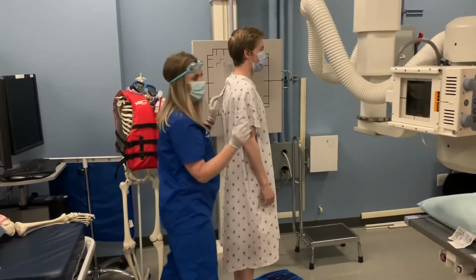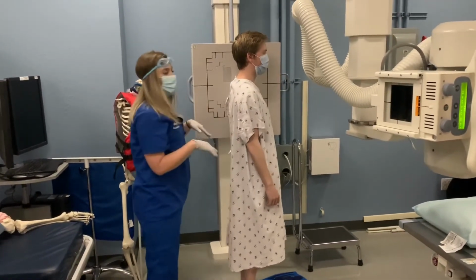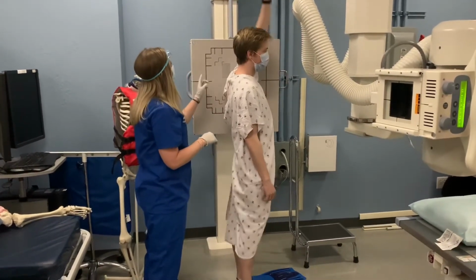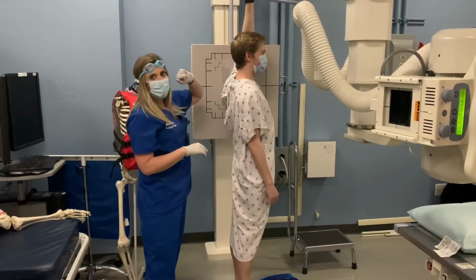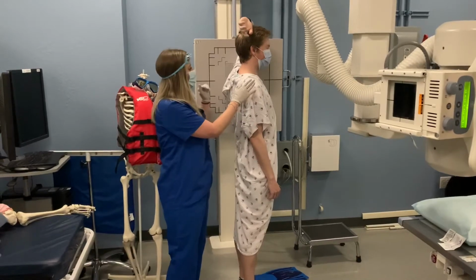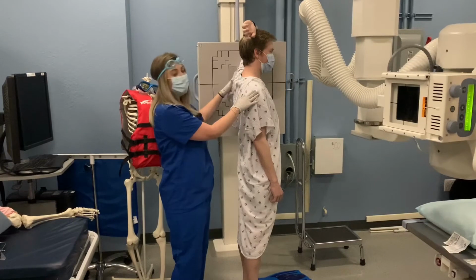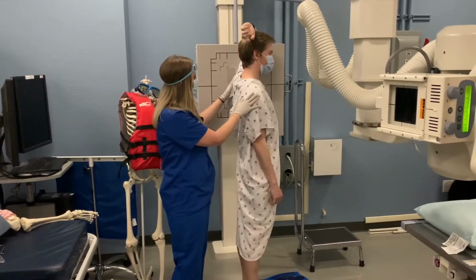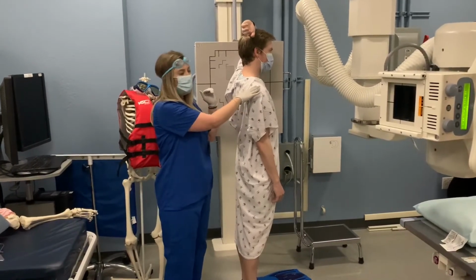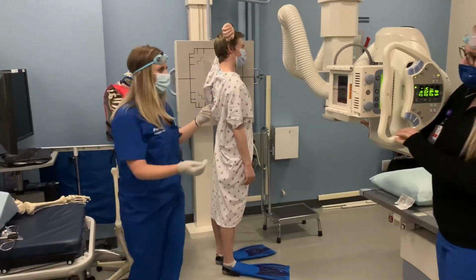All right, now from here, the arm that's closest to the IR is going to be raised above the head, and then the forearm is going to sit on top of the head. From here, we're going to rotate the shoulder that's away from the IR slightly anterior, and the arm closest to the IR is going to get pushed posterior. And then we're going to depress the shoulder that's away from the IR. So now that our patient is in position, we're going to bring around our tube.